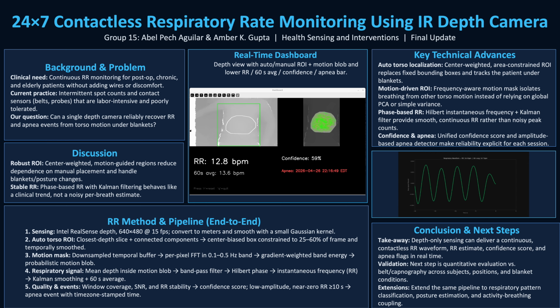One important theme is what we didn't do yet. We have not built a large supervised machine learning model. Many recent camera-based RR and apnea systems train classifiers on sizable labeled datasets. For us, actually collecting that kind of dataset, recruiting subjects, putting reference belts on them, synchronizing depth and ground truth, turned out to be the hardest part. So this semester we focused on a robust, interpretable signal processing pipeline that works with limited data and can later feed ML models once the formal clinical study is in place.